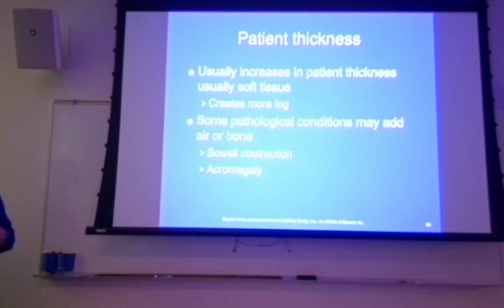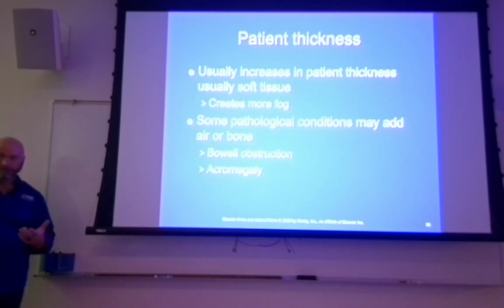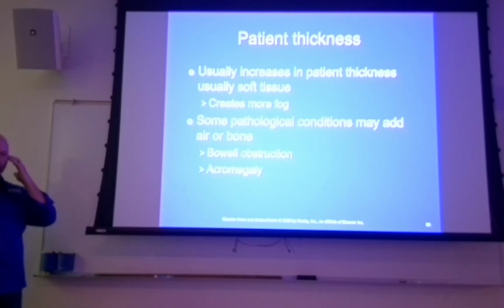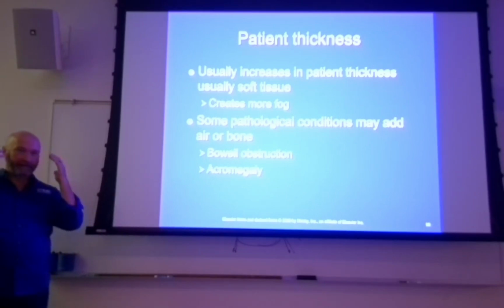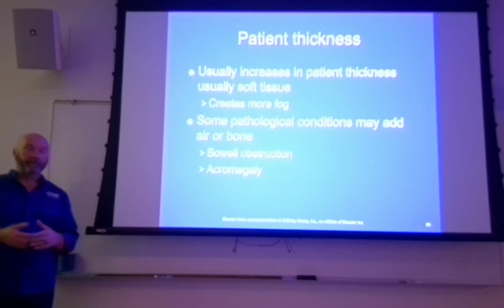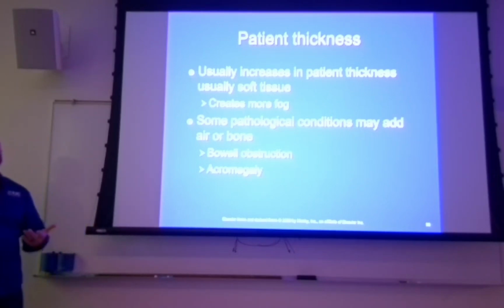As opposed to, you walk into the patient's room and they look puffy all over. They've got a mask on and the elastic in the mask is kind of pushing into their skin, right? And it looks like you laid something on a memory foam mattress. They're probably full of fluid. So if they're full of fluid, you're going to have to adjust your technique too. And in this case, you're going to have to increase your technique.